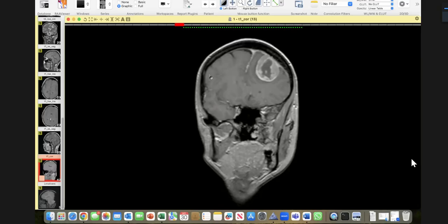So what is the definition of NF2? If a patient has bilateral acoustic schwannomas, NF2. So the definition is done if you've got bilateral tumors. Number two, you are in that number two category. Multiple meningiomas, this was only a 36-year-old. Multiple meningiomas with ependymoma.